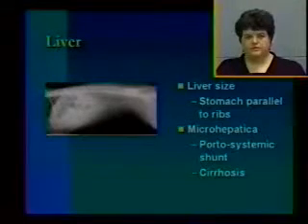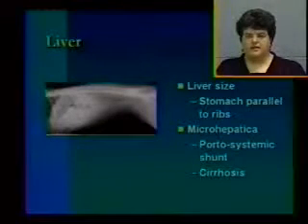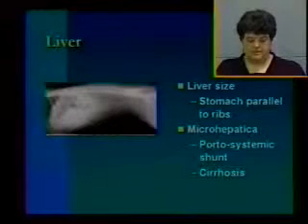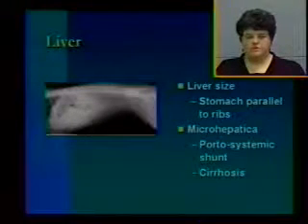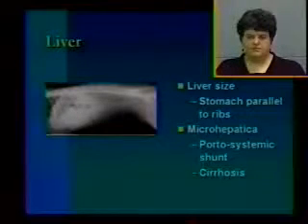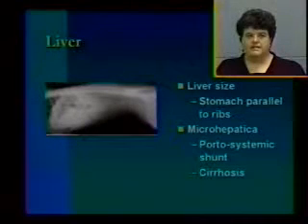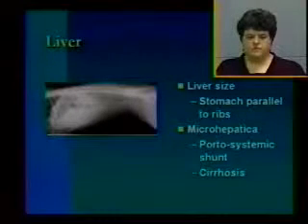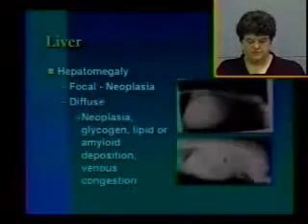Causes of very small liver include portosystemic shunt in little dogs, or long-standing chronic active hepatitis where they actually have cirrhosis and fibrotic changes. You can also have changes in the opacity of the liver. It's a homogeneous soft tissue opacity typically, but if you actually have air in the biliary system or air in the gallbladder, that gives you an idea that you really need to actively pursue an infectious emphysematous disease in the liver that is going to need immediate attention.